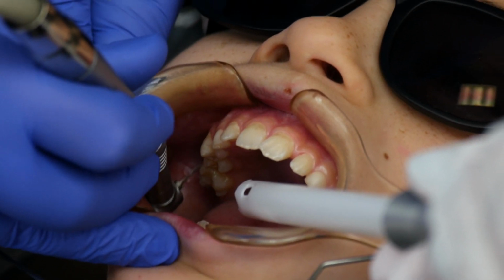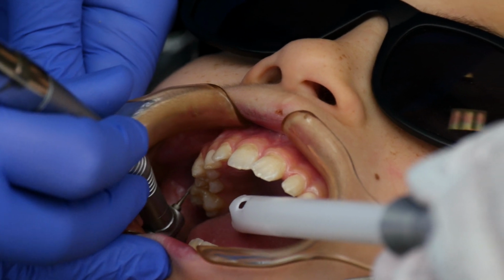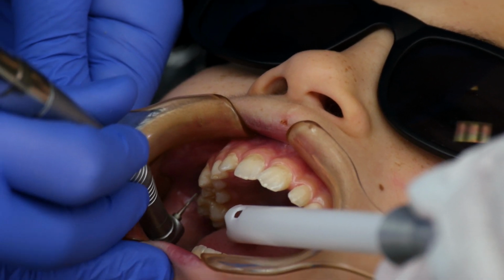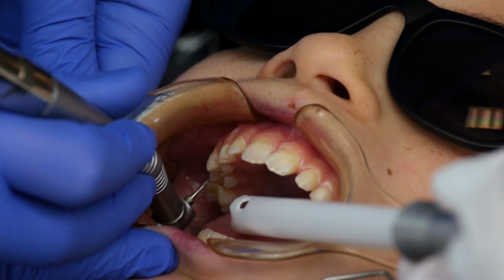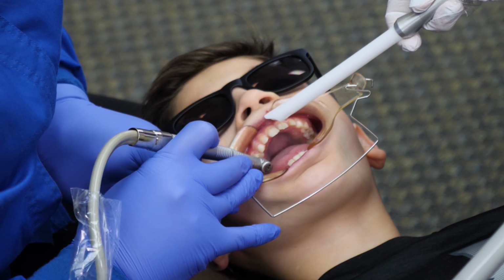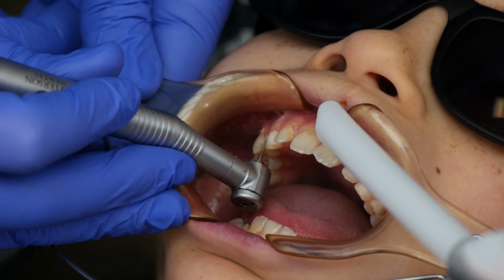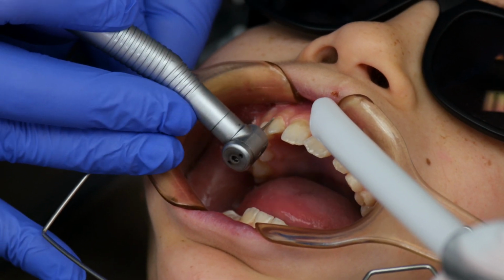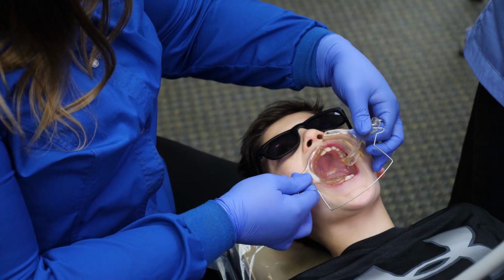A hygienist can complete the CRA appointment. She begins with light scaling. Often most adhesive has been brushed off. Any that remains is very easily cleaned off. The broad surfaces of the teeth are most quickly and comfortably cleaned using a high-speed drill with a 169 carbide burr. I do the majority of CRA appointments on the younger patients, age 6 to 9.